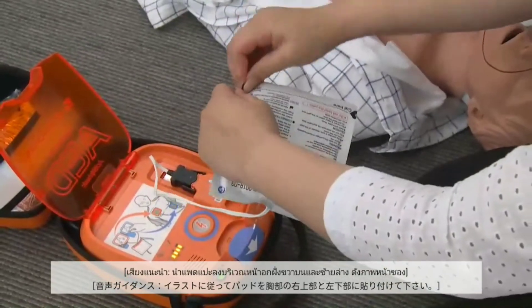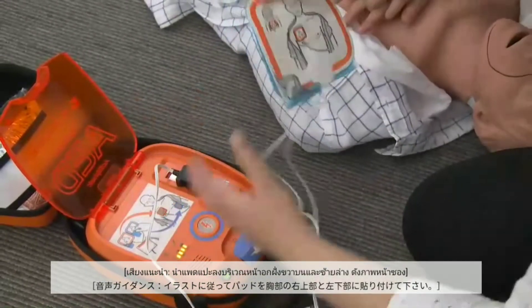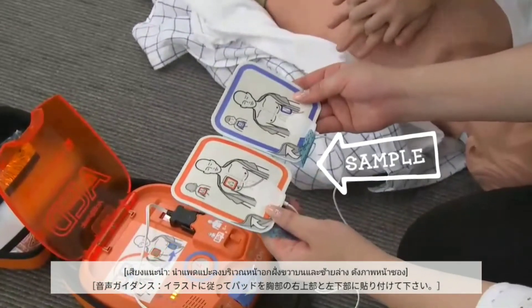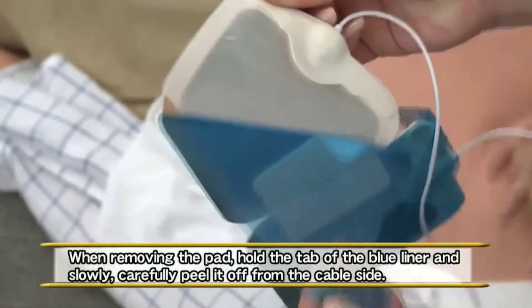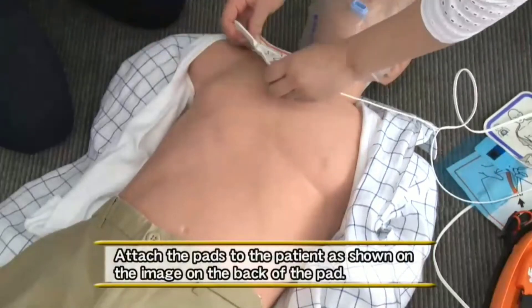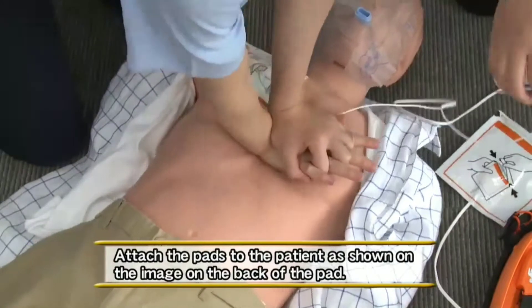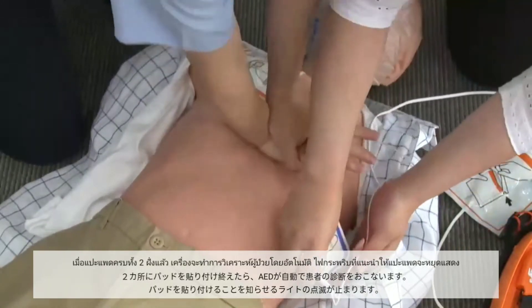Open the package and take out the pads. Remove pads from the blue liner and apply to the right upper chest and left side as shown. When the two pads are attached, the pads placement indicator stops blinking.